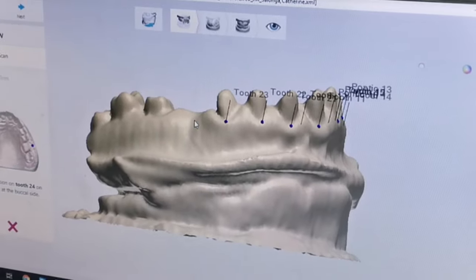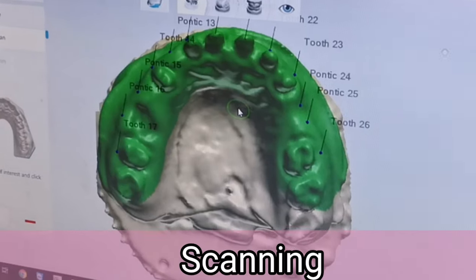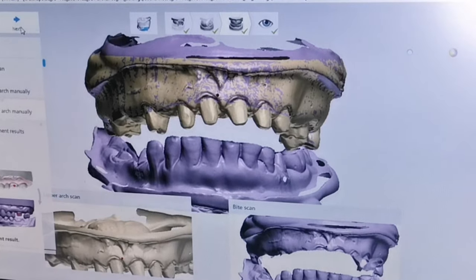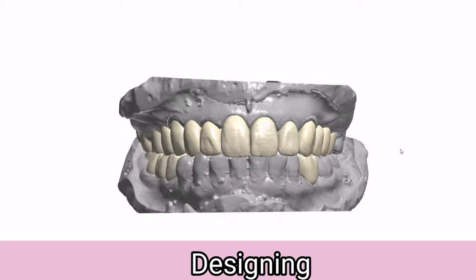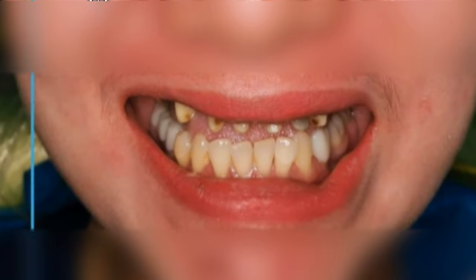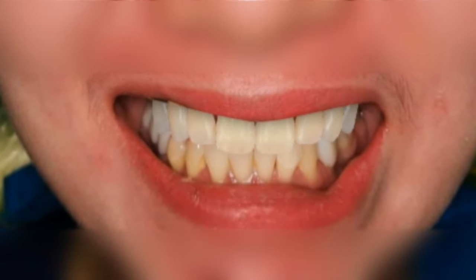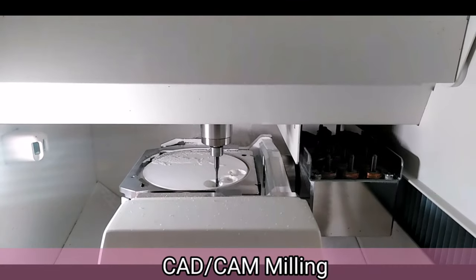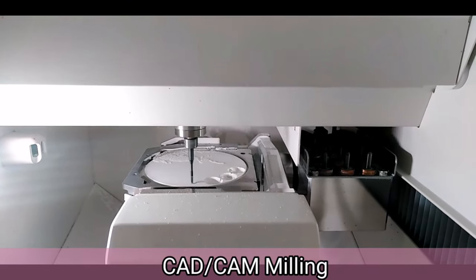After tooth preparation and impressions, the cast models were sent to the lab for scanning, which copies the exact details of the cast model and turns it into a 3D image. The 3D image was sent for designing according to the patient's facial features and preference. I presented her with a digital smile design and tried it on using temporary acrylic crowns. Benefits include being able to visually see the final outcome, altering the design to your liking — making crowns shorter, longer, or rounded — and it saves time and prevents miscommunication. When everything is approved, we give the go signal to the lab to proceed.